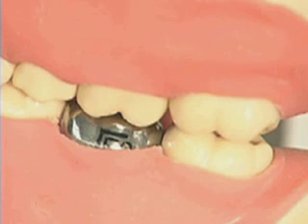Check the occlusion. We now have a crown that is nearly complete and in occlusion. Marginal adaptation has been done. It fits to a point 1 mm below the gingival margin. The only thing left to do is finish and polish, then cement.